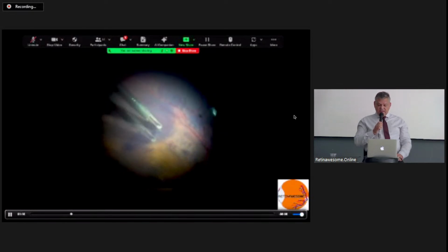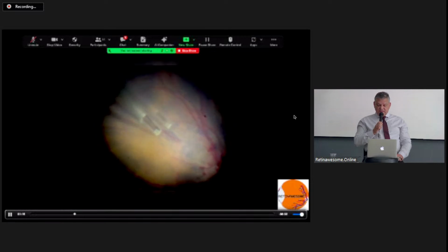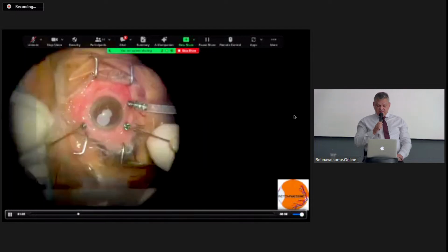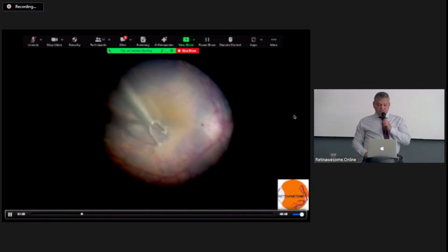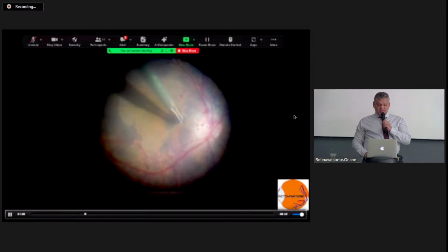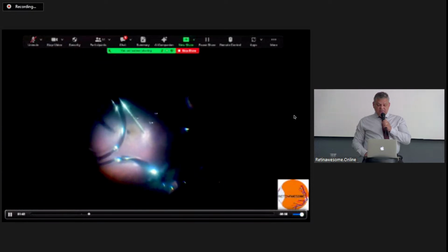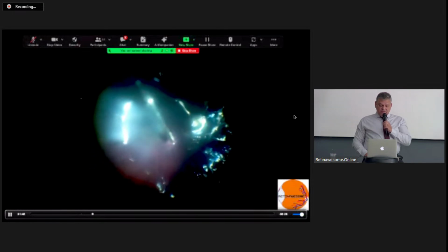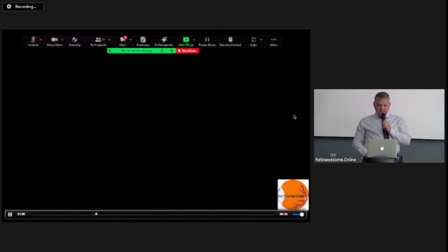And after vitrectomy and brilliant blue, now you separate the epiretinal tissue from the internal limiting membrane. You see that the approach is very gentle. You still see through this small pupil. You have to be very careful not to touch the lens, so you do the surgery very gently. And now I'm using the macular lens and another air fluid exchange. In this case, I put brilliant blue, so in that way it was easy to see the ILM.